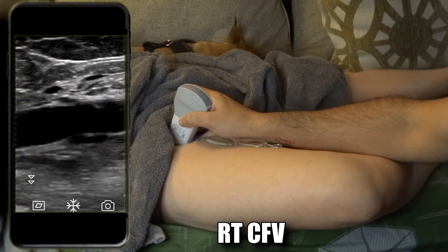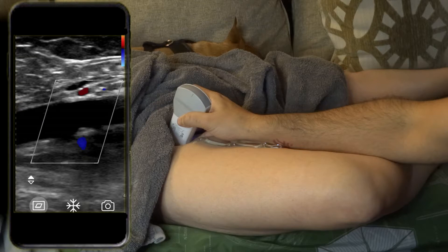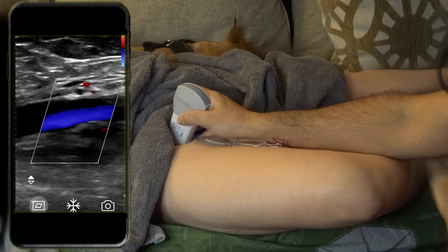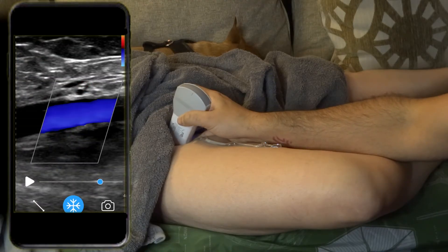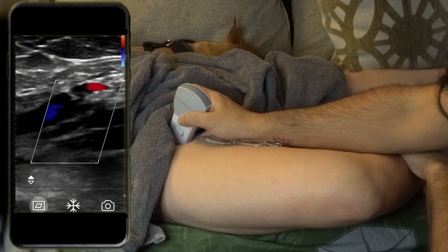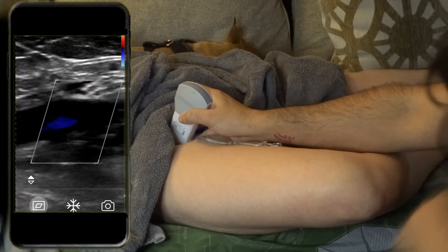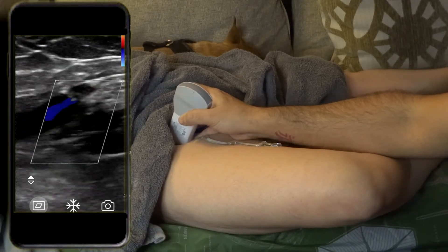Let's come in on the femoral vein. Freeze, take the picture, then color Doppler. In the other video I didn't know how to steer, but now I do — if you press this bar in the middle you can steer it side to side. Take the picture, unfreeze. There's no spectral Doppler on this device, but you can still do augmentation — if you press you'll see the flow increase. Not as functional as a full machine, but still diagnostic.